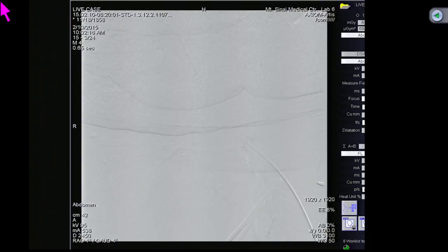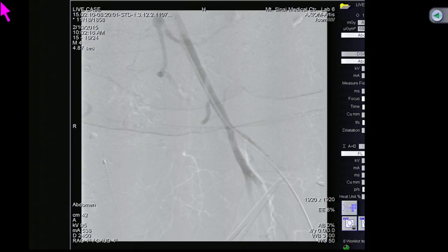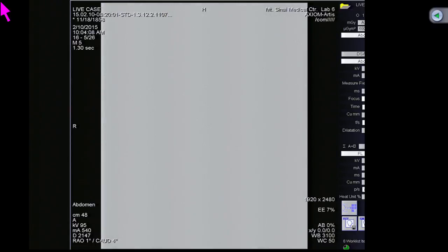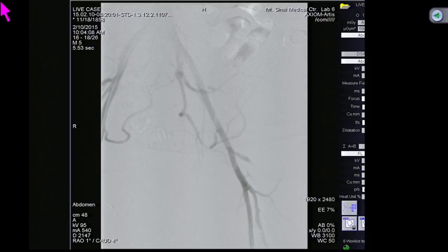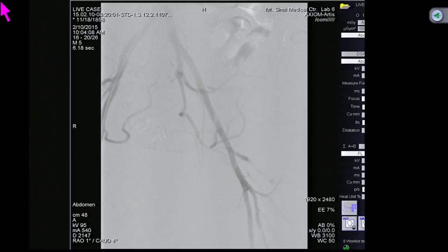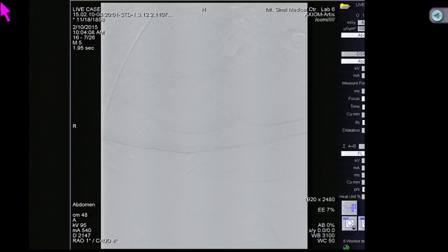So the next step was removing the sheath, deploying the Perclose sutures, tightening them up, but leaving the guide wires in so that in case there's a problem, we can re-access. And you can see we've got nice flow down the vessel, nice hemostasis, and for the final shot, we remove everything and take our final completion angiogram, and you can see a widely patent vessel from the contralateral side. A tiny bit of leak out of the Perclose site, but that will be dealt with by manual pressure. We haven't yet reversed the heparin, so that's what we're doing next, but successful closure with no problems or complications.